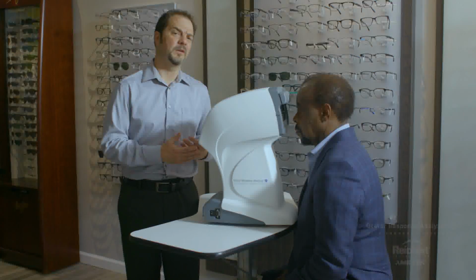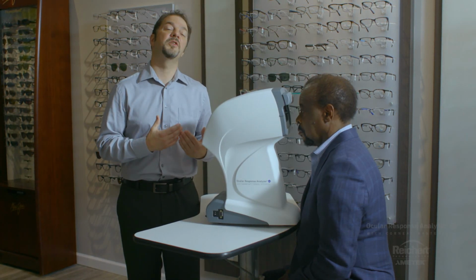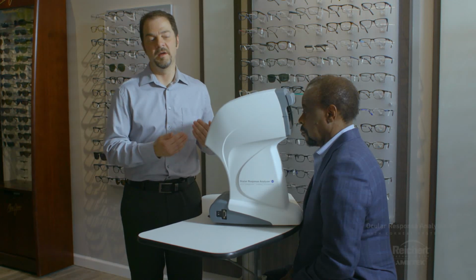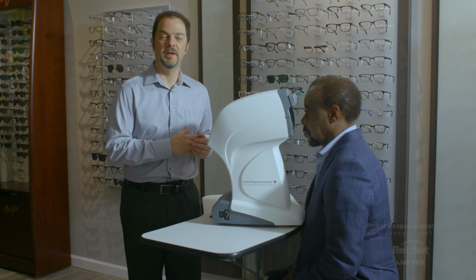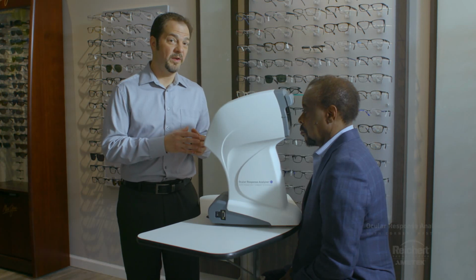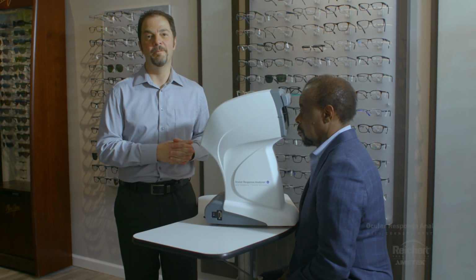There are a number of factors, such as the ocular pulse. Every time the heart beats, the pressure in the eye changes by a few millimeters of mercury. These things can affect the repeatability or the symmetry of the measurements. So when in doubt, make additional measurements. Look at the waveform score, make sure it's an acceptable waveform score, and let the instrument's intelligent averaging system do its job.